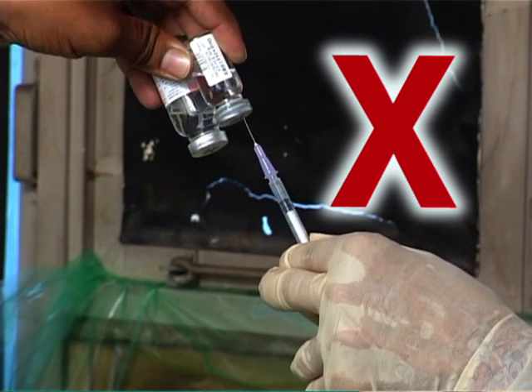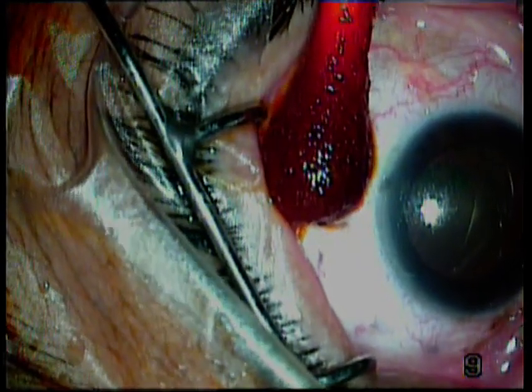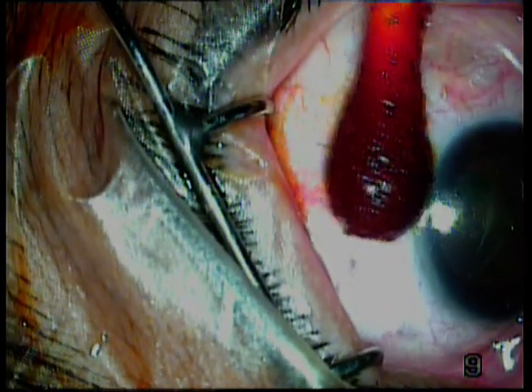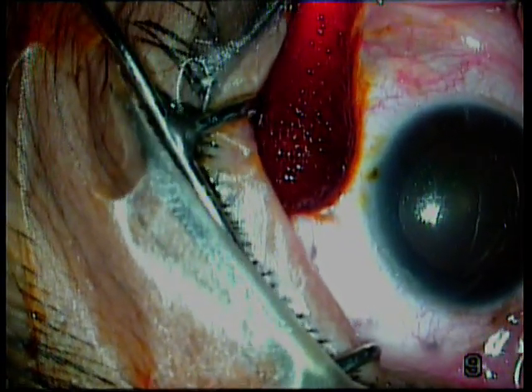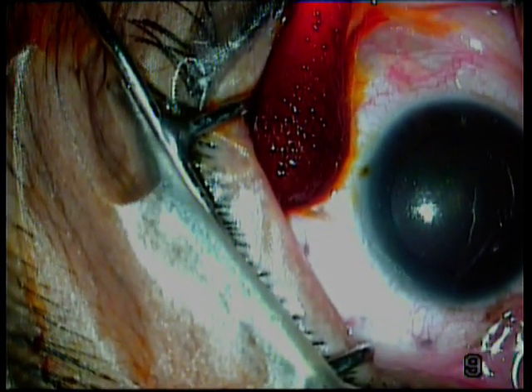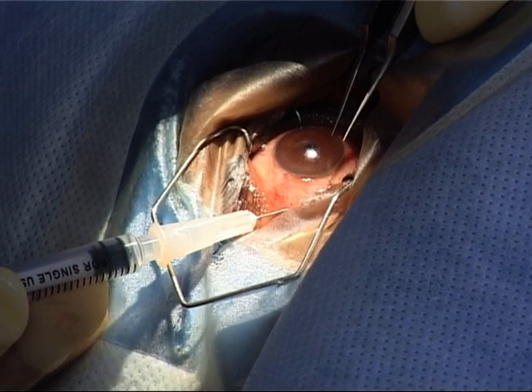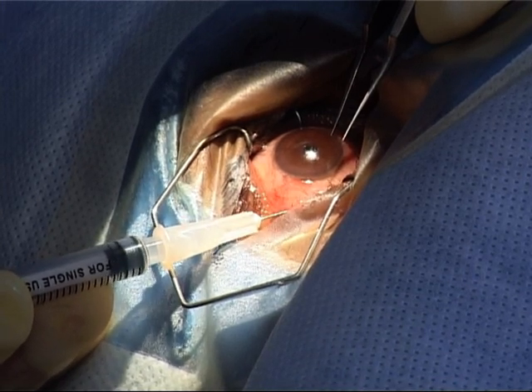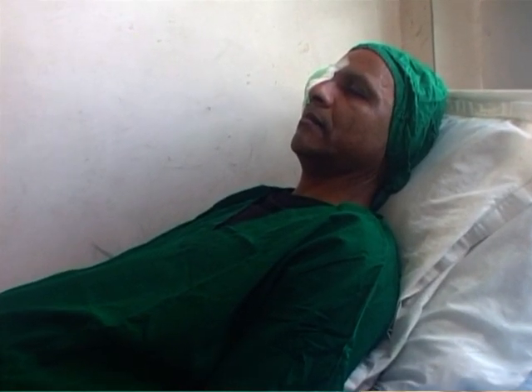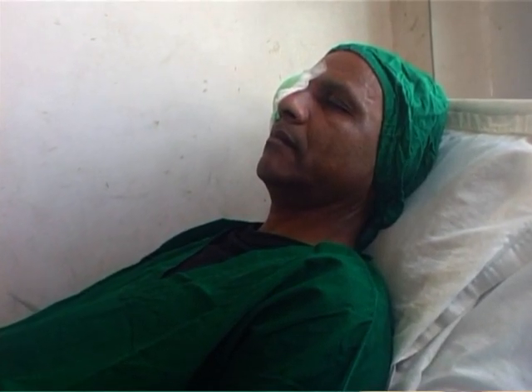Withdraw the needle after administering all injections and press the sclera at the injection site with a sterile cotton bud to ensure there is no leak. Give a subconjunctival injection and patch the eye. It has been suggested that reclining the patient with the head up immediately after the procedure may decrease the risk of the drug settling on the macula and preventing toxic damage.